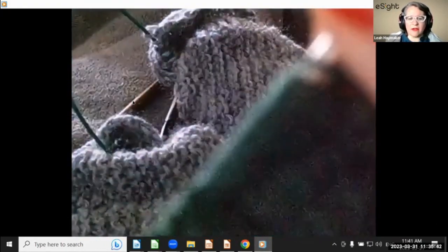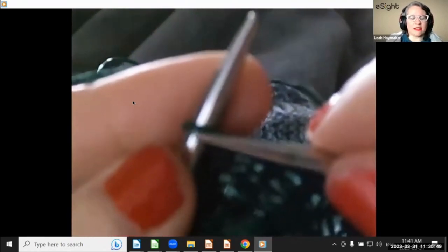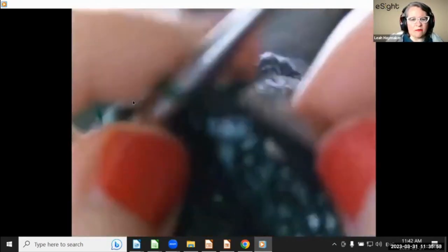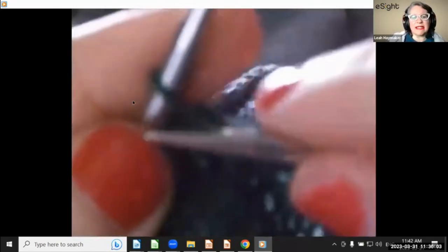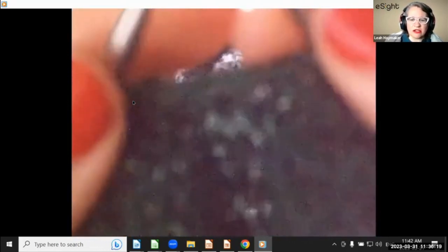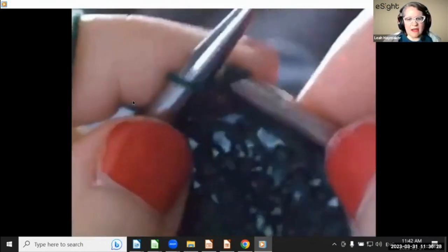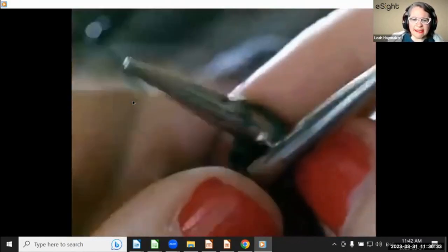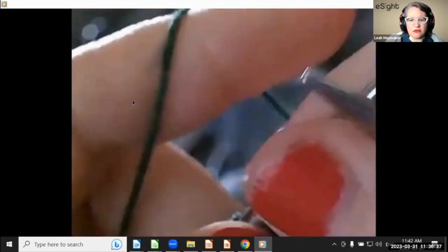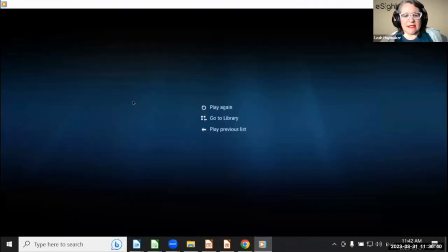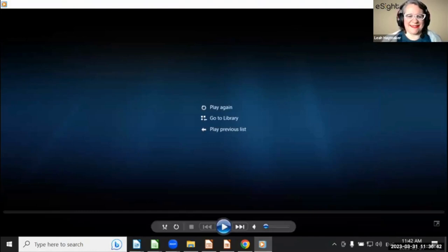Here I'm knitting and I'm using just the zoom. I'm in indoor mode and I have it on autofocus. You can see here when I adjust something, it focuses on the stuff behind me or behind the project. It has a tendency when you're doing close-up stuff, especially when your hands get in the way. So when I use anything for knitting or cross stitching, I actually have a custom tube, which is what this is, and then manual focus, which I will show in a cross stitching video.